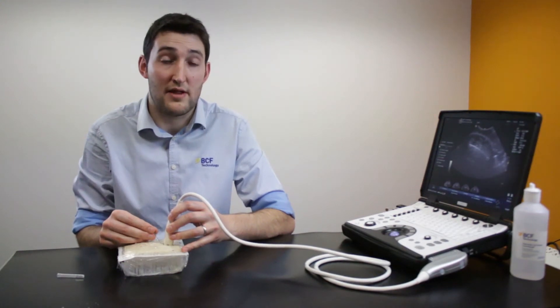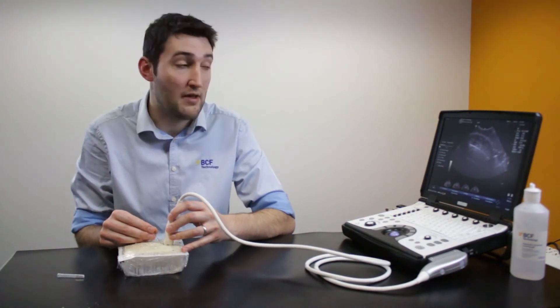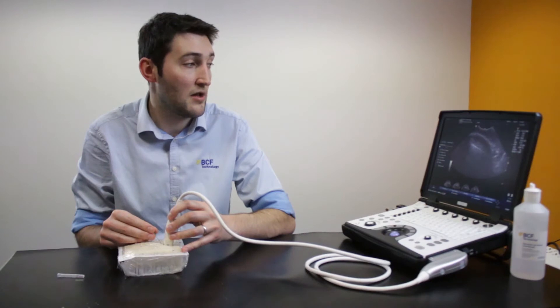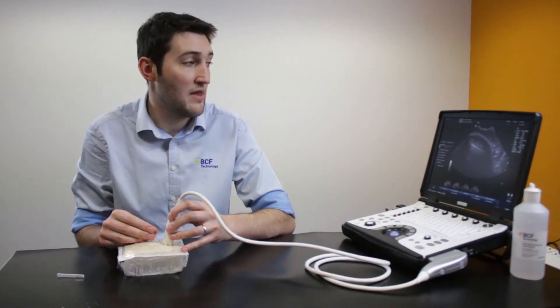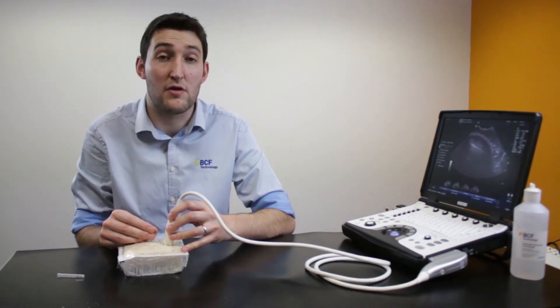One thing that is slightly tempting to do and worth noting is that if you lose the needle off your image, so looking at the image here, I've managed to lose track of the needle.